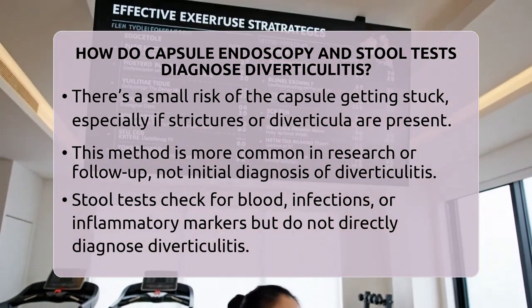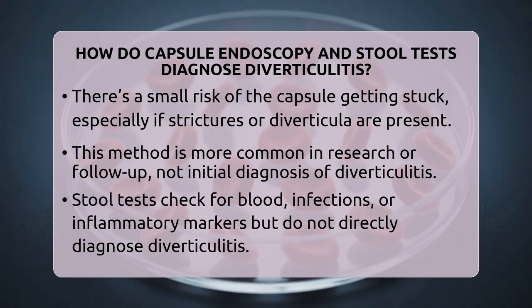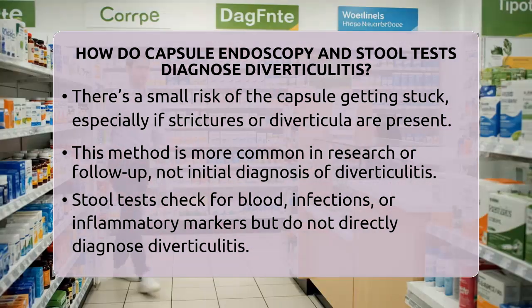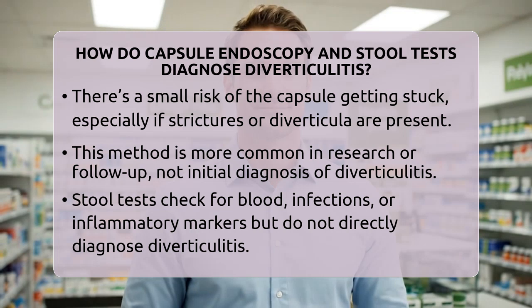There's also a small chance the capsule could get stuck, especially if there are strictures or diverticula, but this is rare. Because of these limitations, capsule endoscopy is more often used in research or follow-up situations rather than initial diagnosis.